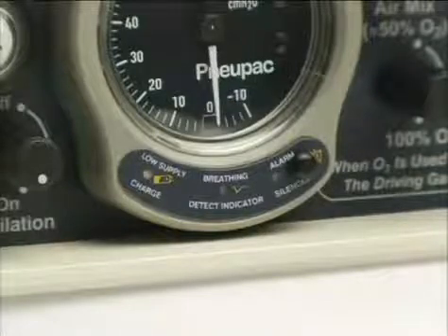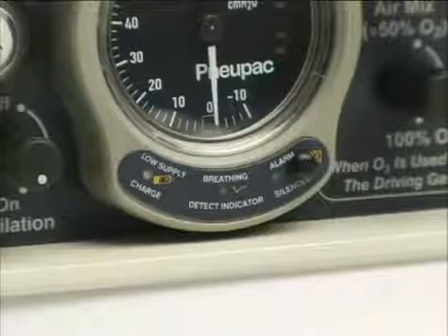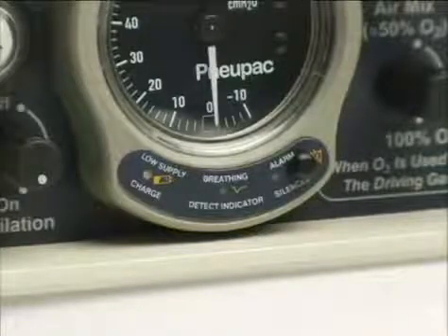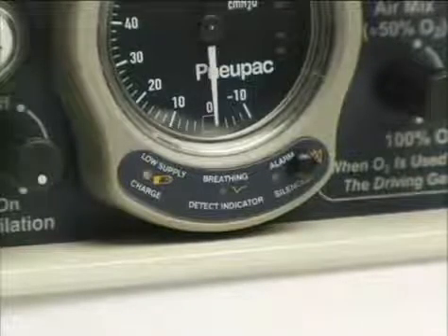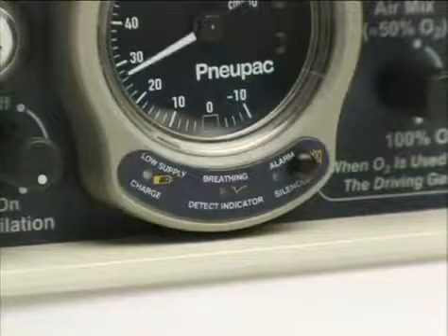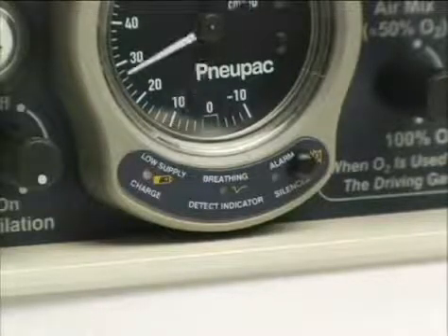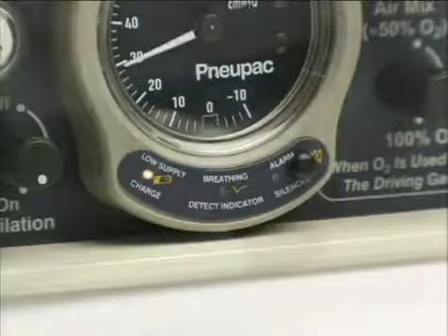When this yellow indicator flashes, the internal battery that powers only the alarm unit is generating reduced voltage. With the recommended battery, the light flashes every 30 seconds for several hours, warning that you'll need to replace the battery. For the final few minutes of the battery's life, the flashing rate increases to 2 times per second and is accompanied by a medium priority audible alarm.